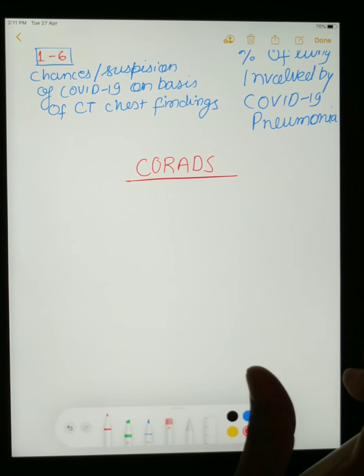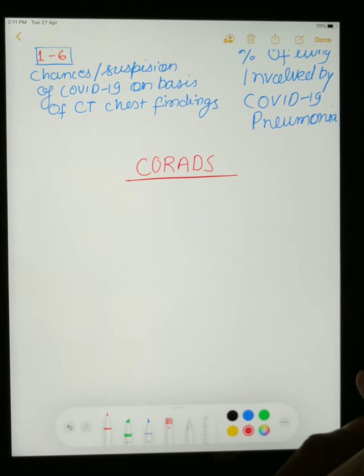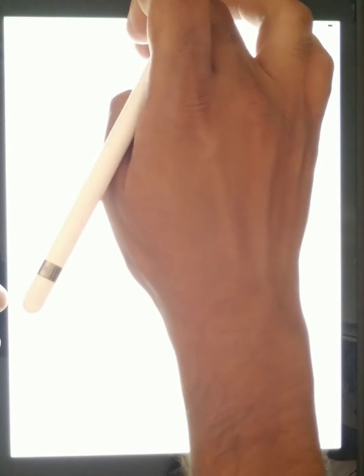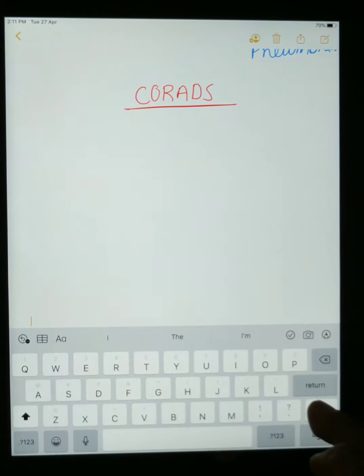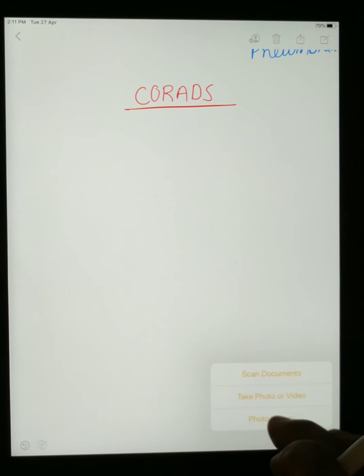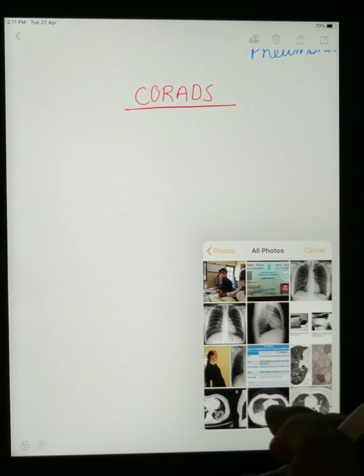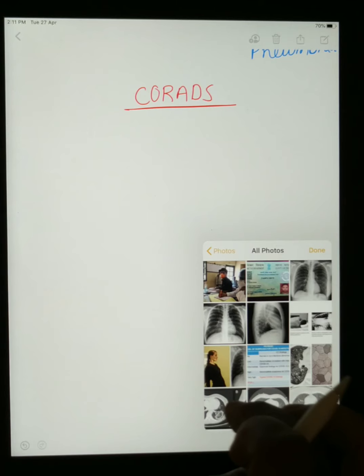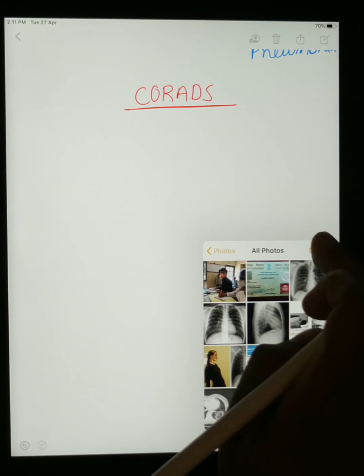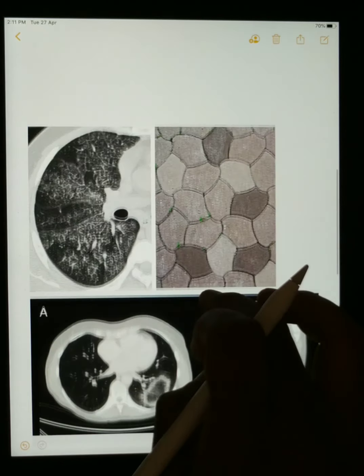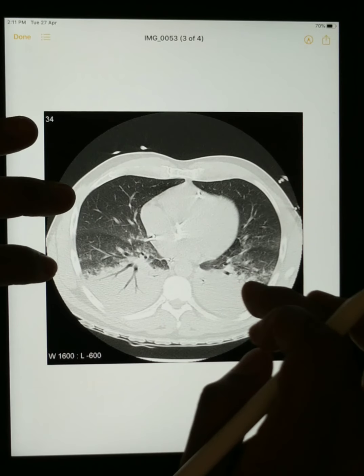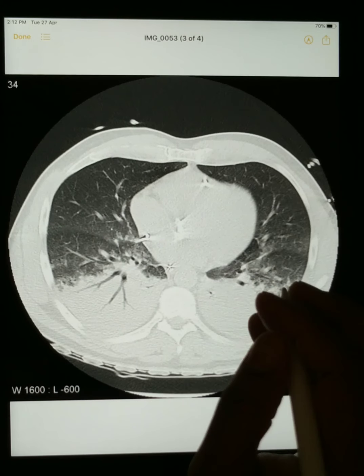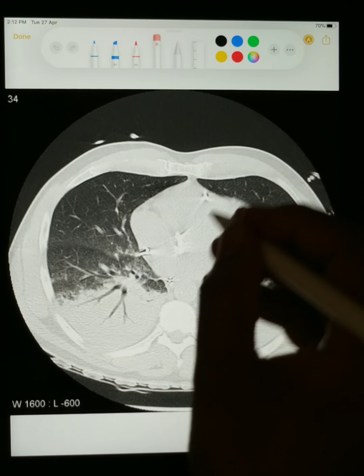We will start with CORADS scoring. Before proceeding, I will show you some pictures of CT scan which are typical of COVID-19, so you can easily differentiate them on CT. First of all, I will show you what consolidation is.